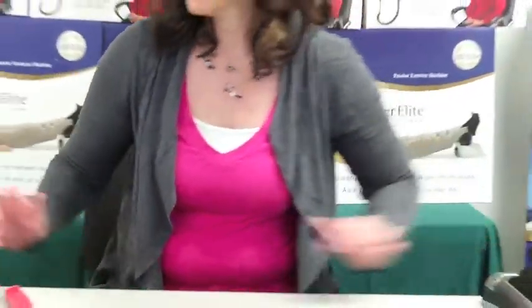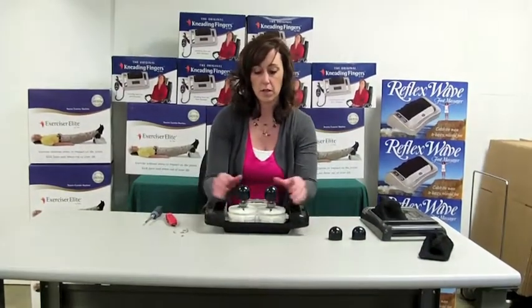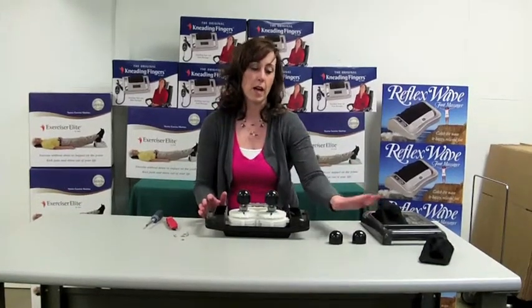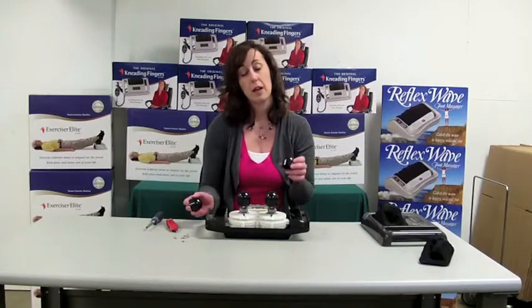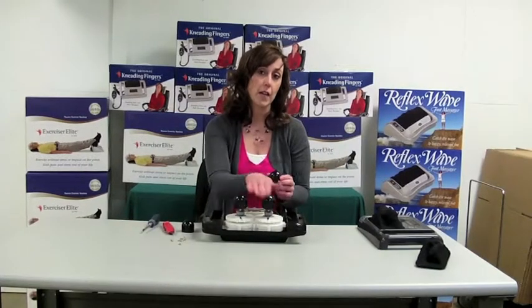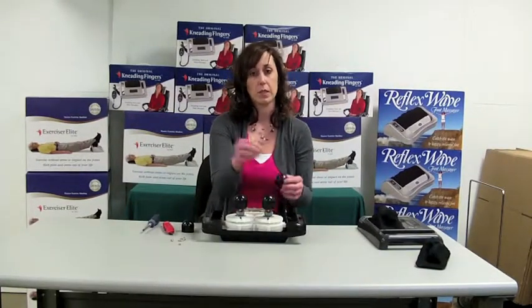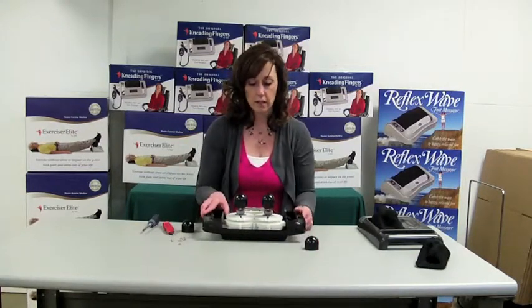Put on our top case. Now we will replace the caps on the massage knobs. Every time we send a fabric out, we also include two plastic caps. We recommend that you change these out every time you replace your fabric, as there might be a hairline crack in the caps from use, and putting new ones on will help your fabric last longer.